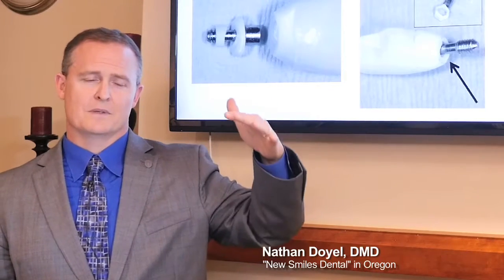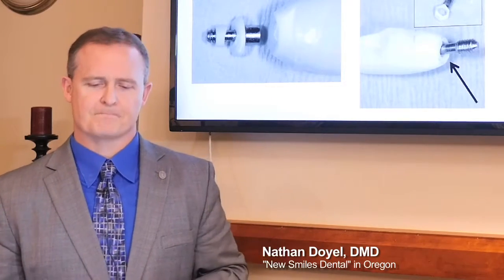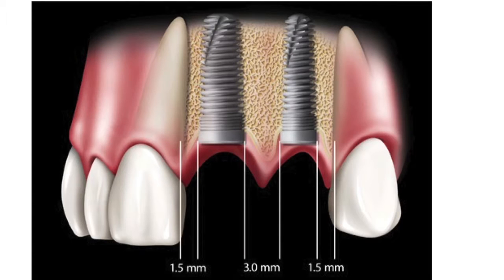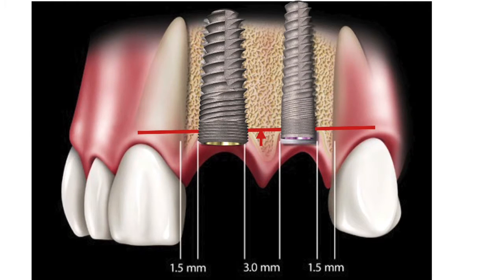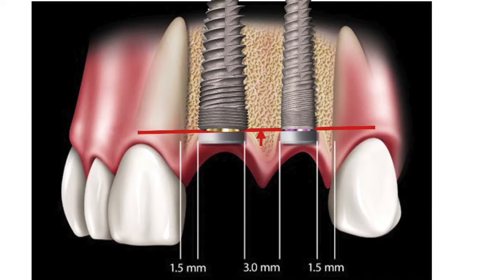You want titanium to contact titanium. So again, adjacent teeth, but also one of the problems we have is not placing your implant deep enough. And this is showing a case where the implants were placed at the height of the adjacent contour of the teeth, the zenith of the teeth.